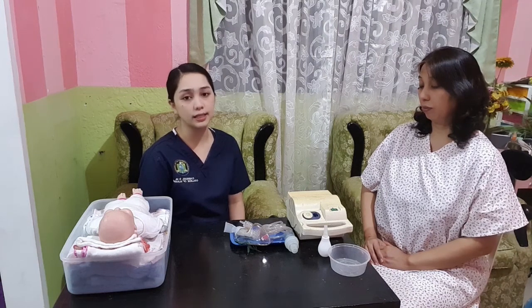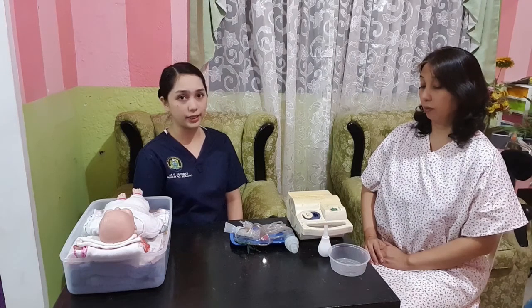Next is I will teach the patient the proper way of inhalation. So here I will be teaching slow inhalation via the mouthpiece, short pause after inspiration, slow and complete exhalation, and then some resting breaths before deep inhalation. So this improves effectiveness of medication.